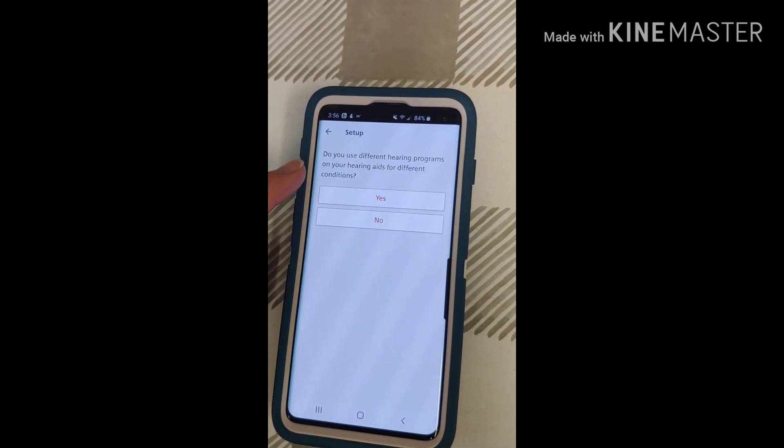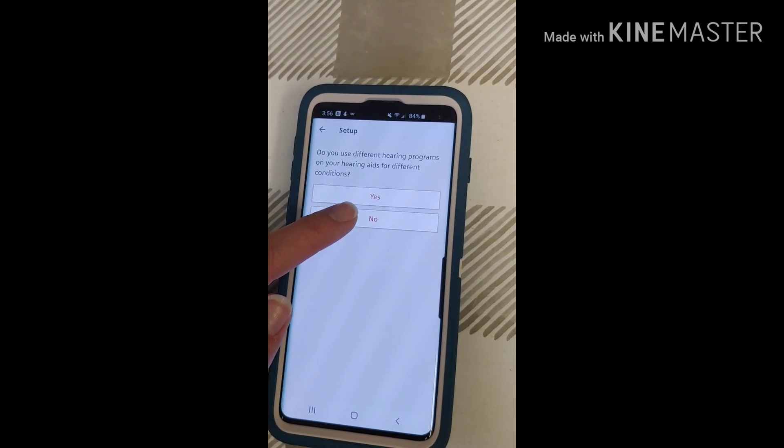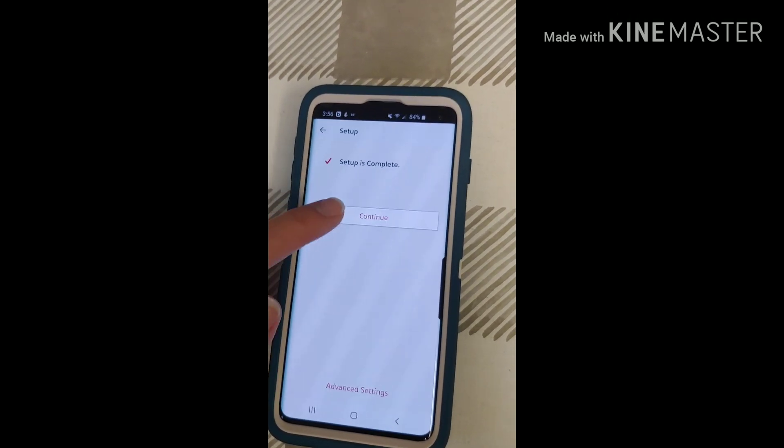Do you have different programs? If you do, hit Yes. If not, if most of your settings are automatic, just hit No. The setup is complete.